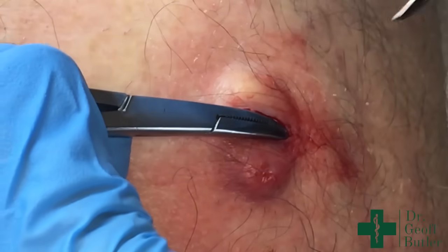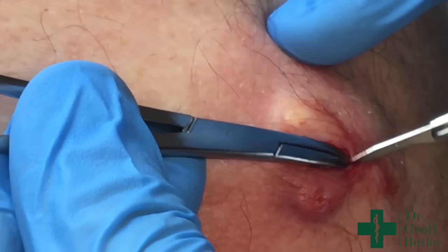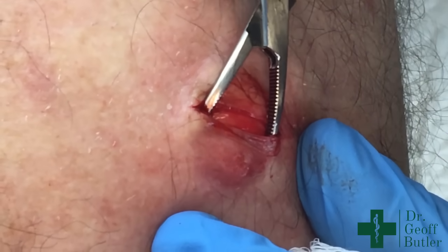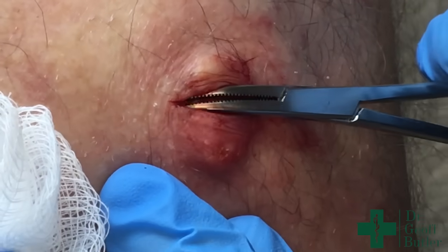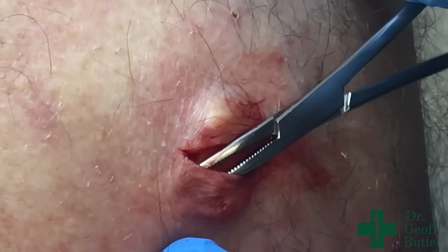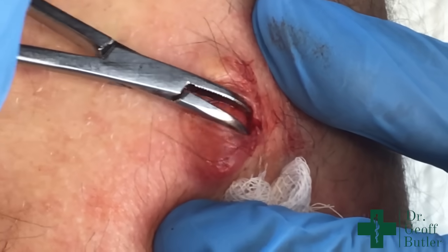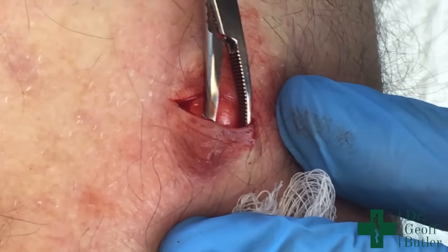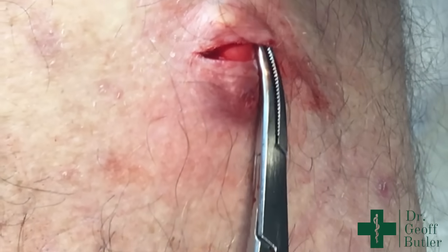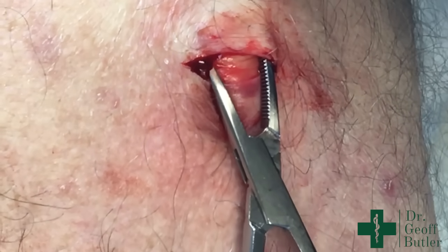I'm going to do that on both sides. You'll appreciate when I'm doing that — you can see underneath — that it's sweeping nicely to that side. There's a little bit of an adhesion up through here which I'll try and break down a bit. This can be somewhat frustrating to watch on video because it just looks like I'm doing the same thing repeatedly. But this is one of those situations where you just take a little bit of time — it does help a lot. You can see there, that's breaking down that adhesion.